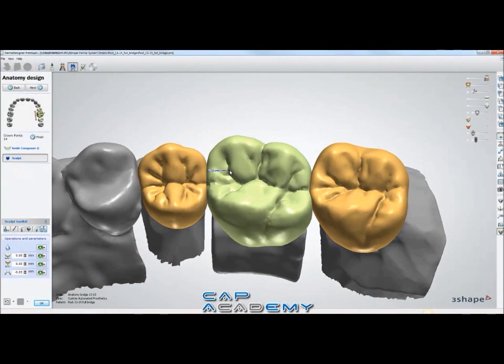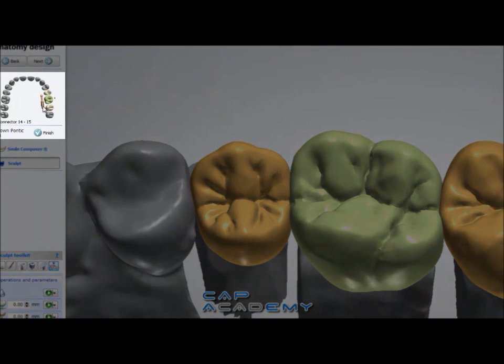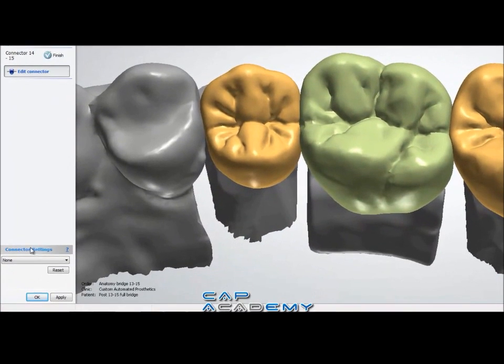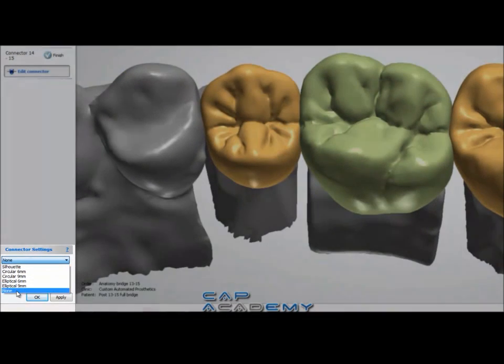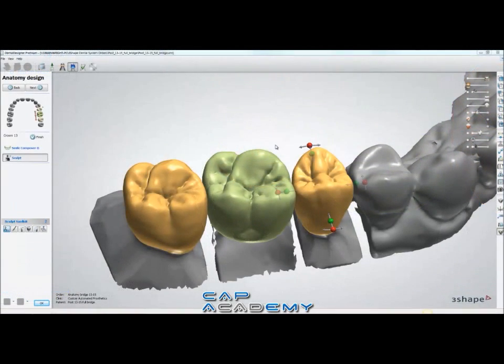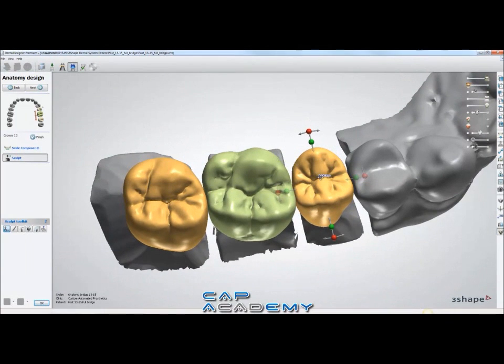At the top left in design, you'll notice you can select the tooth or the bridge connector itself. I'm just going to select one of the bridge connectors, the rearmost, and then down at the bottom left it'll give you connector settings. So instead of having Silhouette or Elliptical 9mm, you just select none. This is a good way to change it — say if you're doing anatomical and it comes in default as Silhouette, you can come back and fix it.